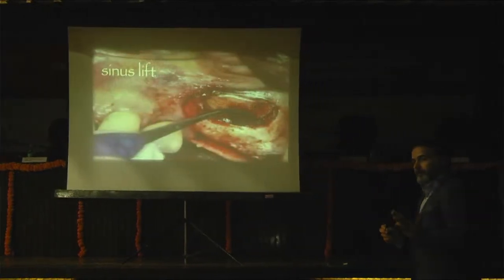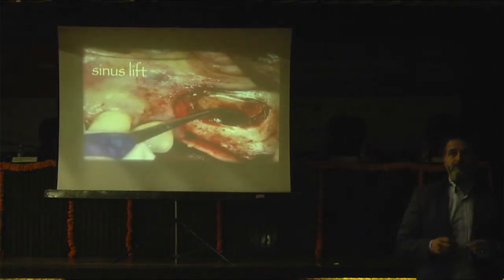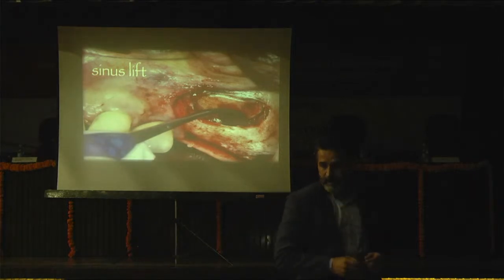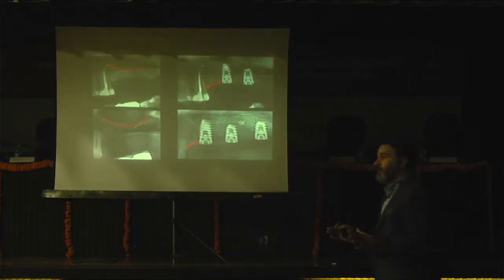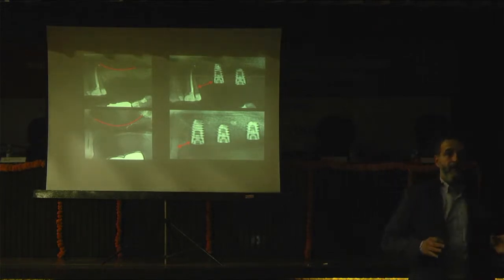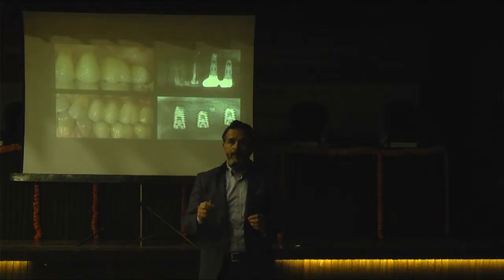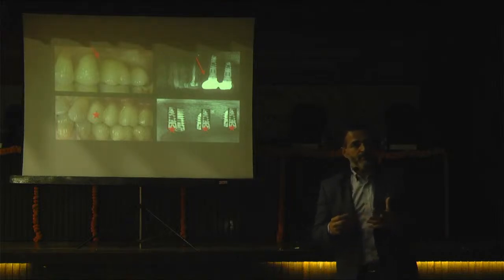The first thing that comes to our minds is the sinus lifting procedure, because we like to do surgeries. We like to open the flap. We like to touch the bone, okay? And after the sinus lift operation, we make the augmentation, and we place 2 or 3 healthy implants. They are healthy, they are in a good angulation, but after that, we finalize the prosthesis, and we remember something. Oh, the patient wanted me to make 2 or 3 crowns, okay?